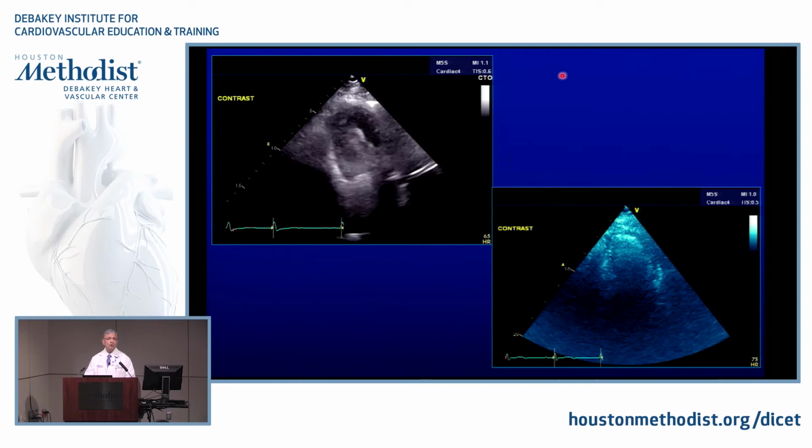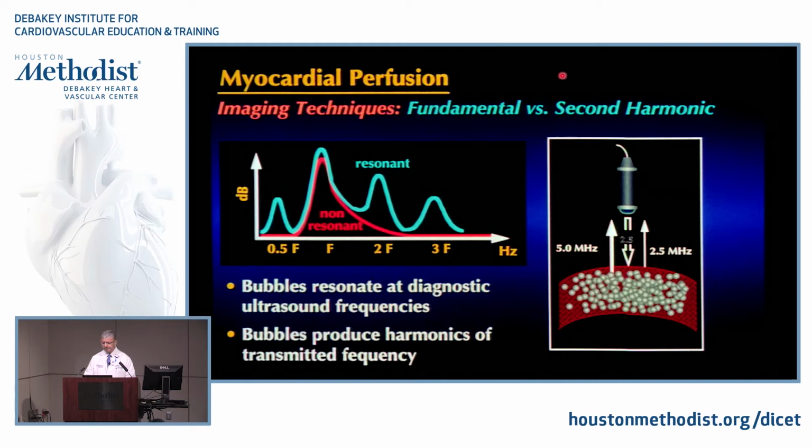Got it? Okay. So, number one, mechanical index knowledge. With a higher mechanical index, you're going to destroy, so you go to a lower mechanical index. Most of these contrast settings are already there. Number two, in most of these machines, except maybe one, is the need to use harmonic. And why? Harmonic imaging is very interesting, because it was actually pushed to be developed for contrast.